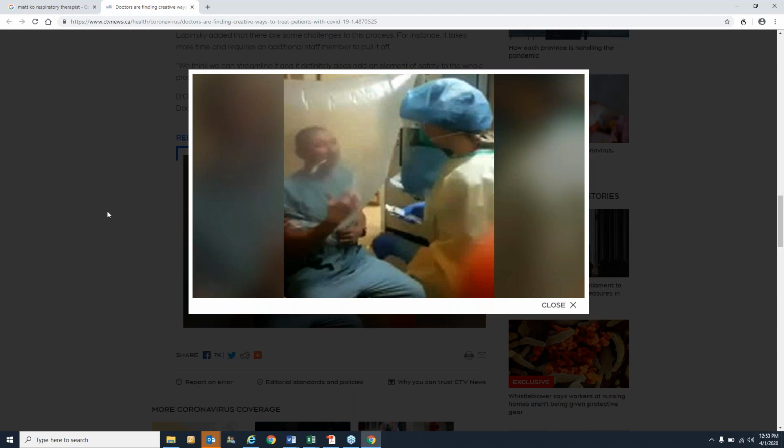Cuff leaks, you can do that prior to it, or just prior to extubating. That's something that might be site specific, but have everything ready to go and explain to the patient. Then immerse the patient into the bag, and have it go down as far as it can, past the shoulders. The anchor fast, the apparatus that holds the ETT, was undone.